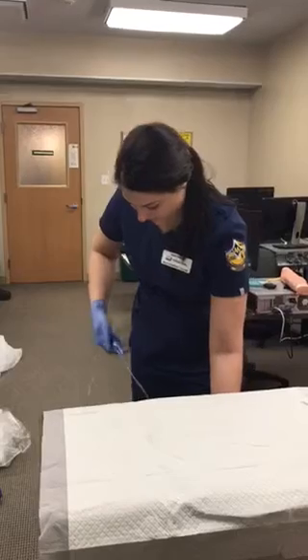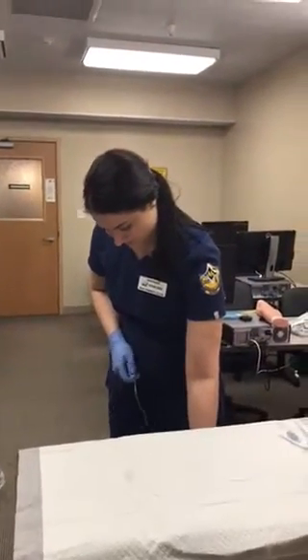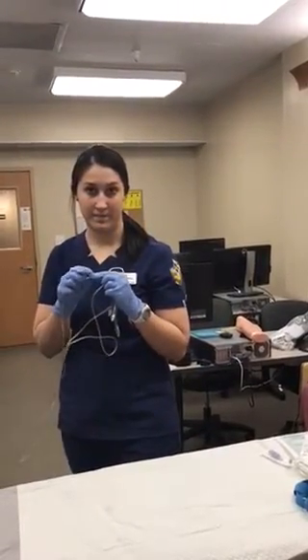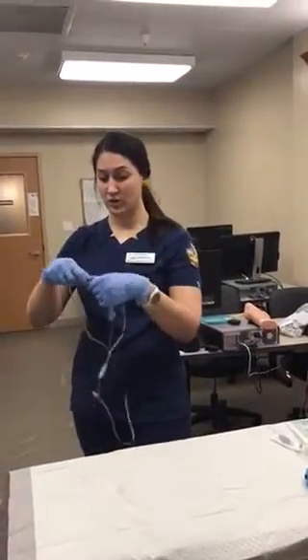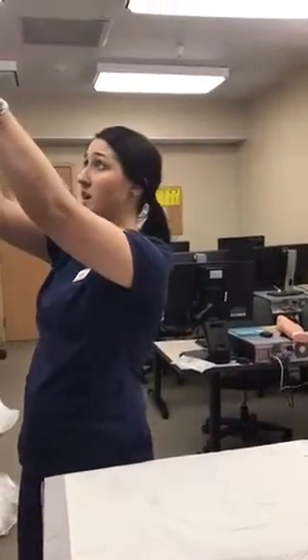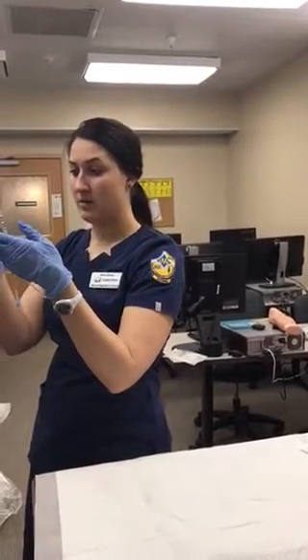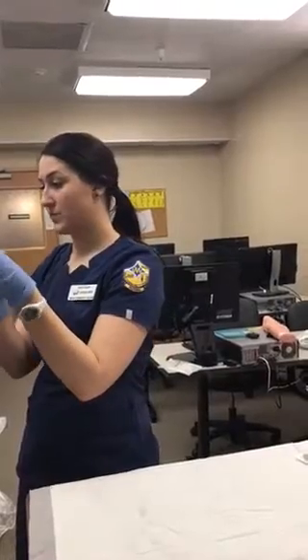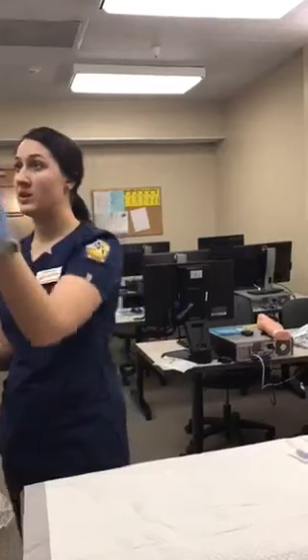So I'm going to close back the clamp. Perfect. And then again, the secondary safety one here. And then I'm going to make sure to take my tubing and hang it over so that when we take it into the patient's room, we don't want it dragging on the floor. We want to maintain its sterility. And we want to make sure the clamp is all the way down. So all of that looks wonderful. We have the secondary on that, so that's hanging up there nice and safe.